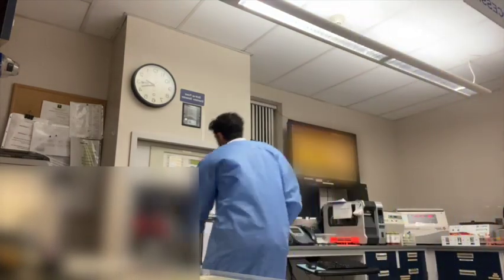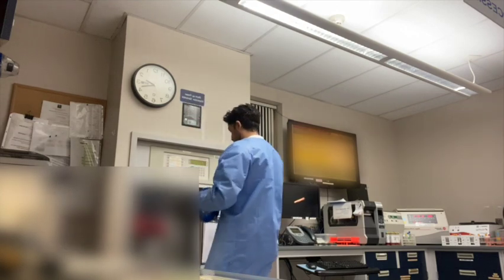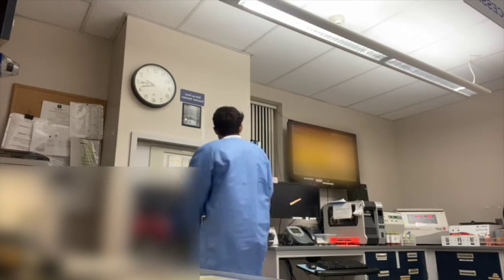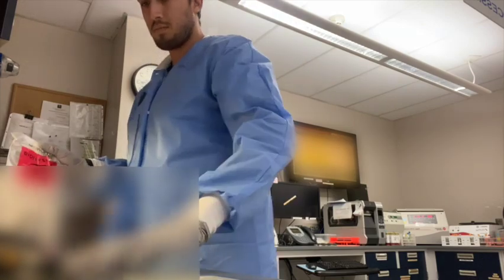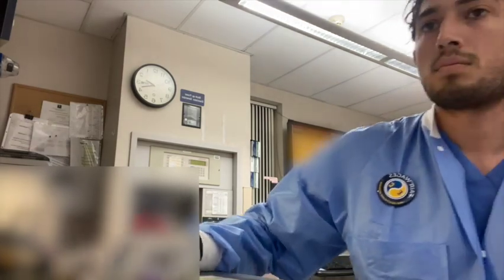After calibration and maintenance has been done, I can begin processing and receiving samples. So here I am receiving a sample that was sent to the lab through the tube system. I'm going to go ahead and grab the specimen, and then I'm going to go ahead and begin scanning it to mark it as received in the computer system.